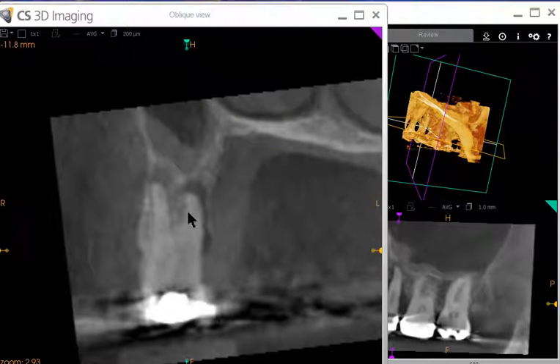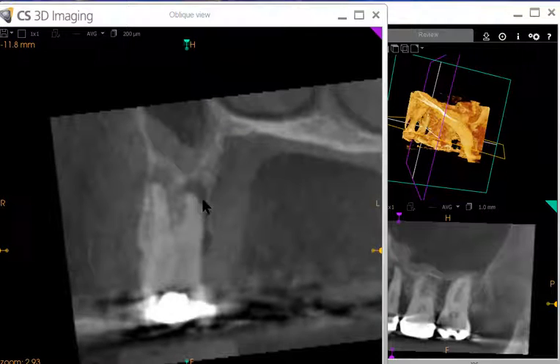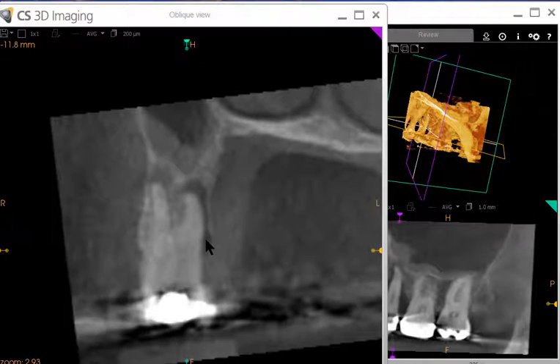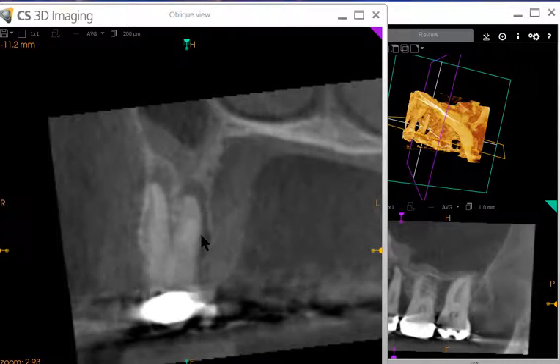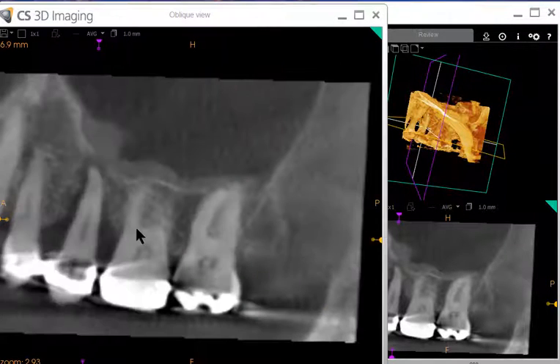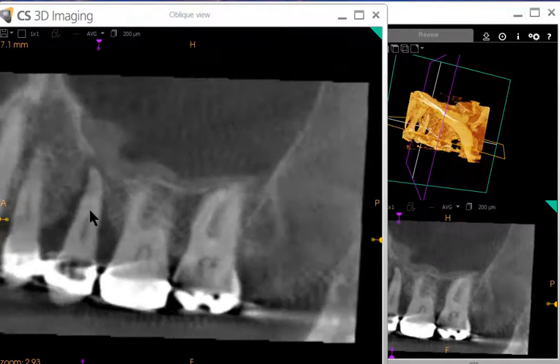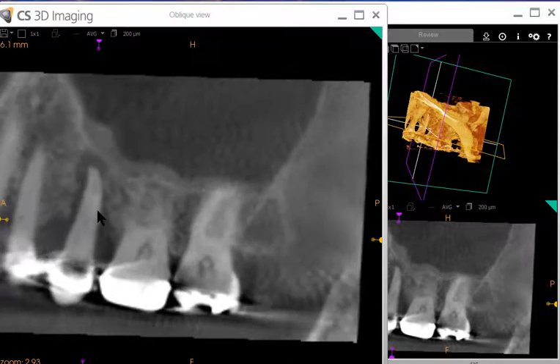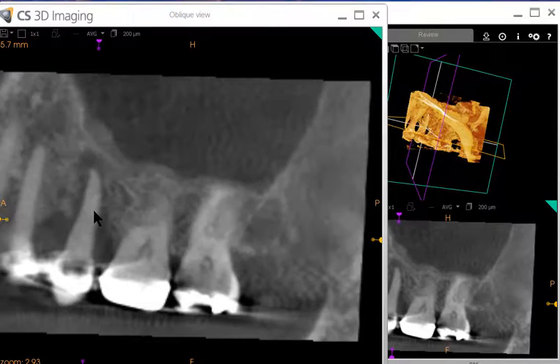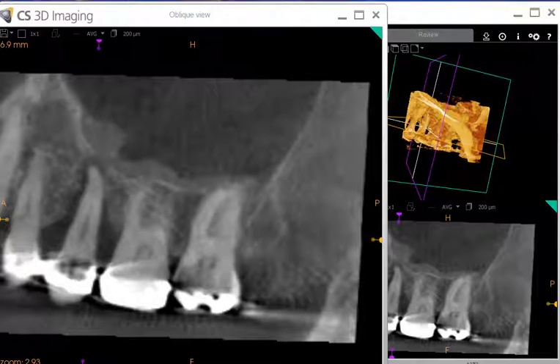You may recall that I mentioned in the lecture that cracks are full of bacteria — oral bacteria work their way in, and if the crack extends into the root, that bacteria causes inflammation in the periodontal ligament and eventually bone loss. Even though you may not be able to see the actual crack itself in the root, you can oftentimes see the bone loss that resulted from the crack. This is the sagittal view — we're going to scroll back and forth — and this is the palatal root.